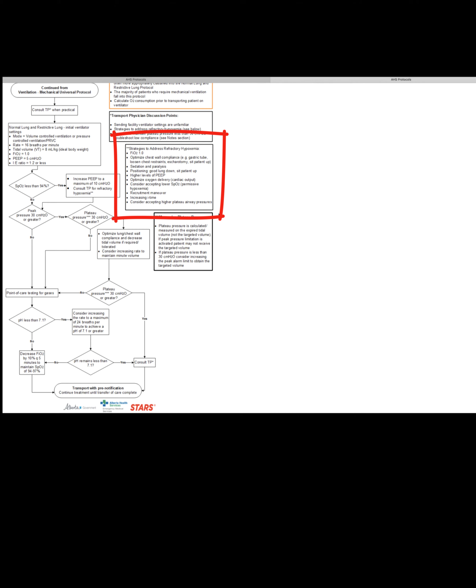Well, let's say that same patient with SATs of 88% is doing really well. Stable hemodynamics, a normal lactate, no evidence of end organ perfusion problems. Before you intubated them, their brain was working normally. They were conversing with you, just dyspnea. Well, maybe that's a patient where we consider 88% okay because there's no evidence of tissue hypoxia, and to accomplish 94% in this patient, I'm probably going to need to get my plateau pressure to 35, 38, I don't know, something higher where we're getting more uncomfortable about potential lung injury from higher pressures. So that's the concept of permissive hypoxemia.